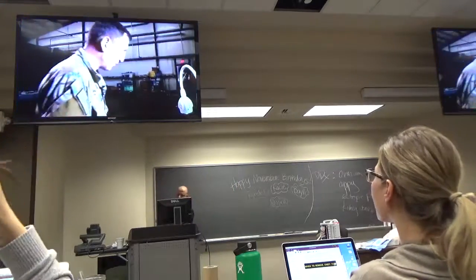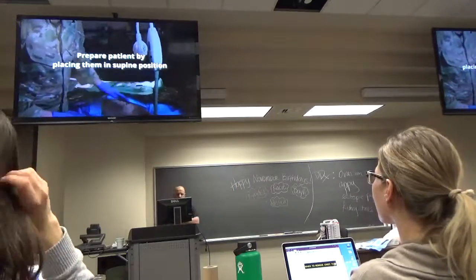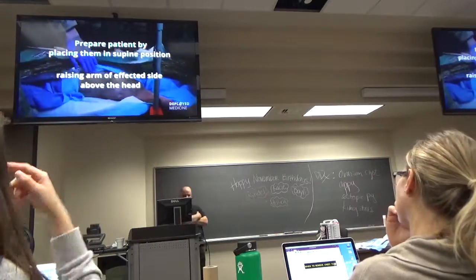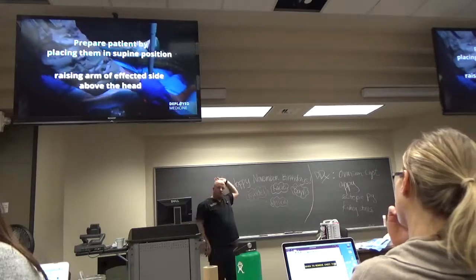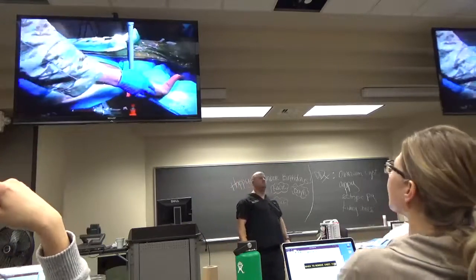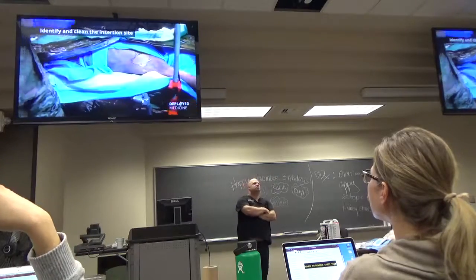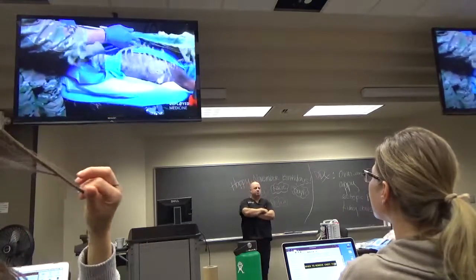The first thing we're going to do is prepare the patient by putting them in the supine position and go ahead and have the affected side's arm raised above their head. We're going to identify the area and then clean it appropriately. In this situation, it's the left side of the chest.